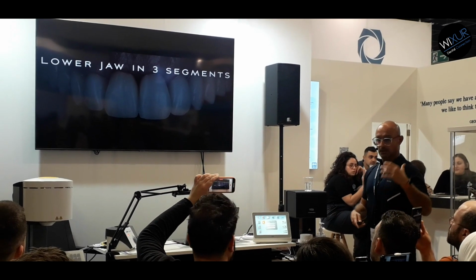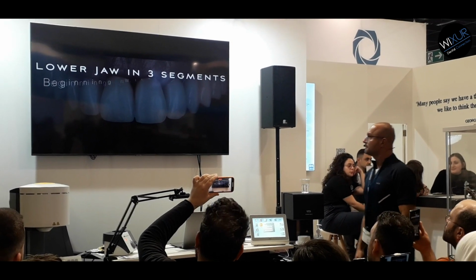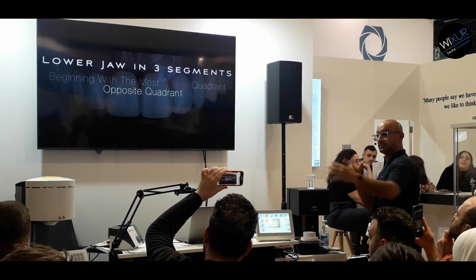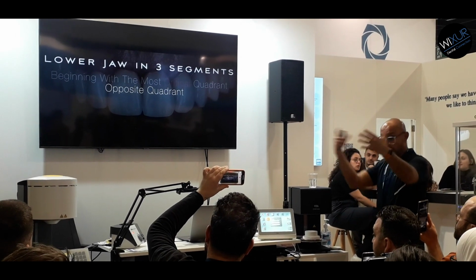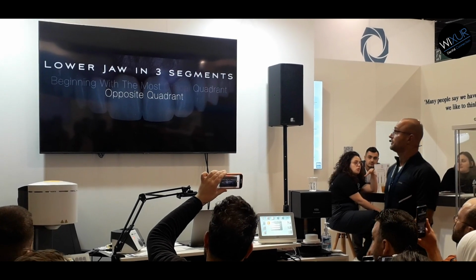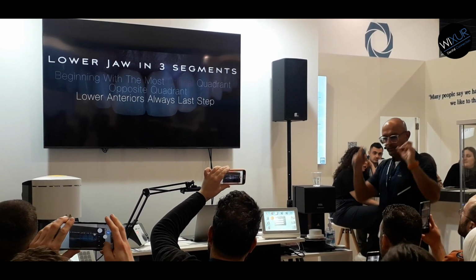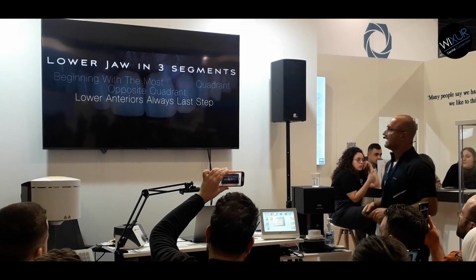We start with the most difficult segment, and then 1 month later the other segment for posteriors, and the last one is anteriors, because we want to take all of the biological and mechanical problems out of the system.